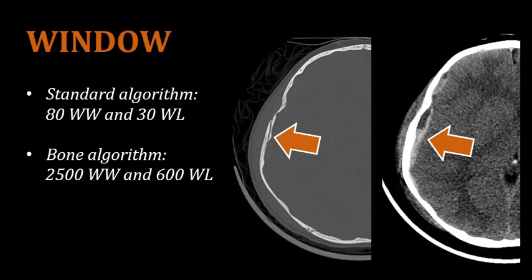When represented correctly, these settings clearly display very different structures. The image to the left is a bone algorithm in bone window settings, showing a fracture in the parietal bone. The same slice on the right was reconstructed with the standard algorithm at 80 window width and 30 window level — this does not show the fracture, but it does show an epidural hematoma at the level of the parietal lobe in the same area where the fracture was. That is why it is important to reconstruct the brain with both standard and bone algorithms and display them correctly.